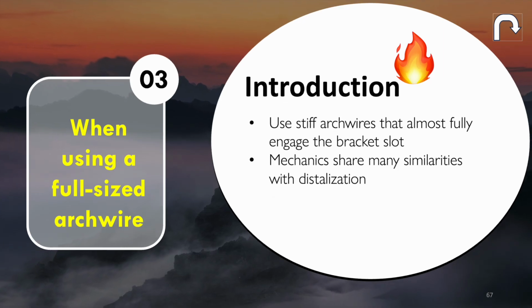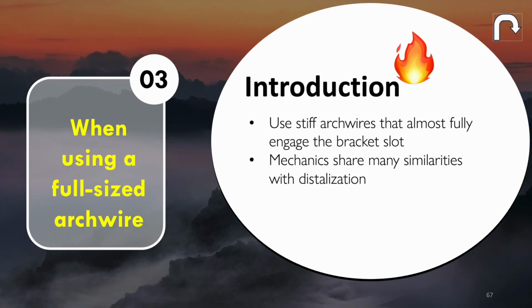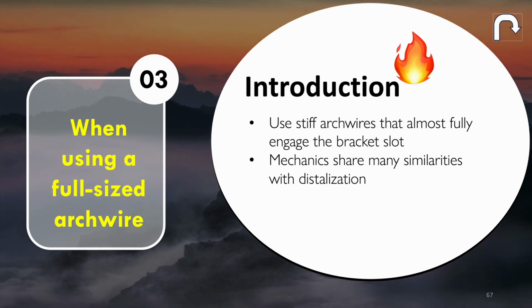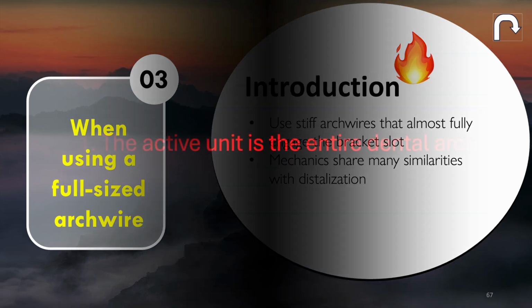We move on to another section. So now, what if we use a full-sized arch wire? The active unit is the entire dental arch.